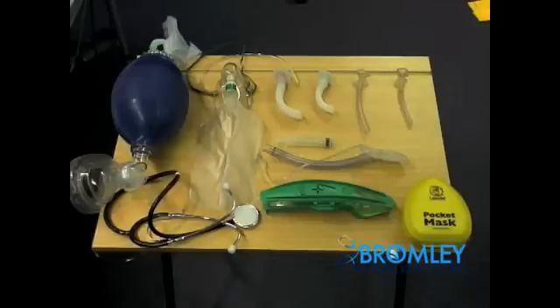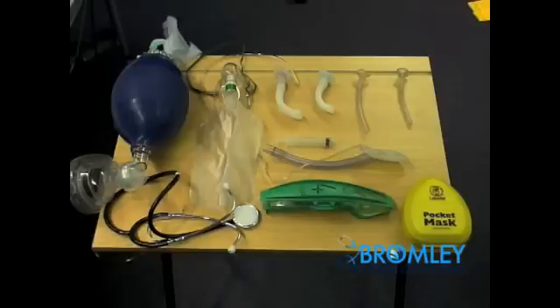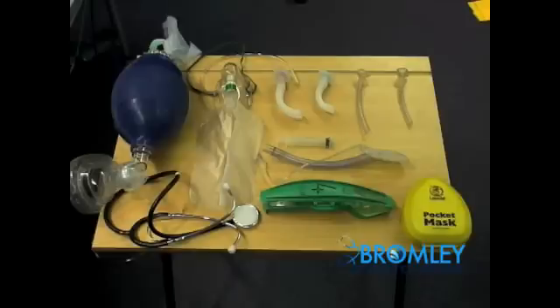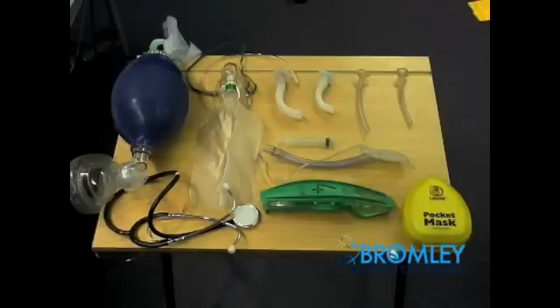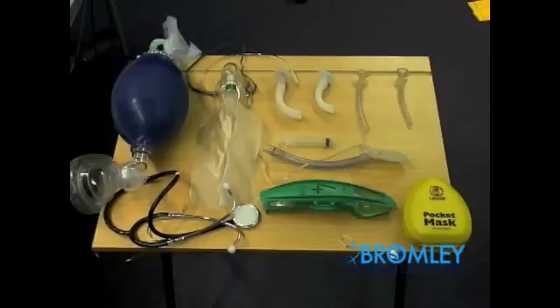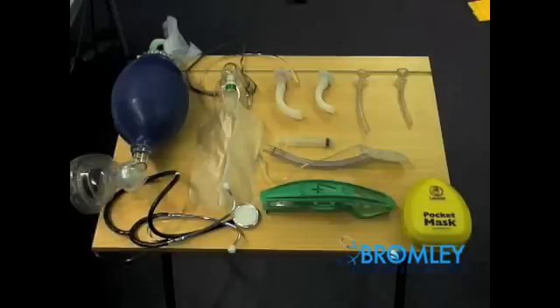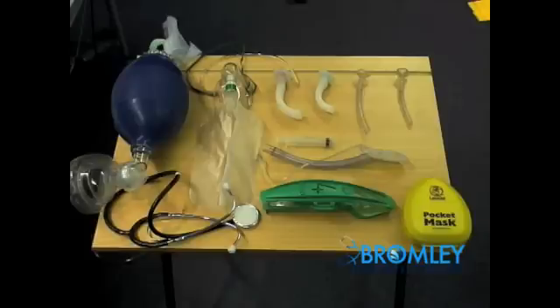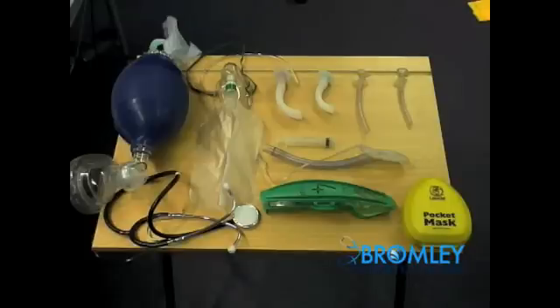This procedure video will revise the importance of assessing an airway, utilising appropriate airway manoeuvres, using appropriate airway adjuncts, and then assessing when a definitive airway may be required. Take some time to familiarise yourself with all the equipment shown here — these are the likely things you would be asked to demonstrate to a medical student and expected to utilise in an arrest situation.